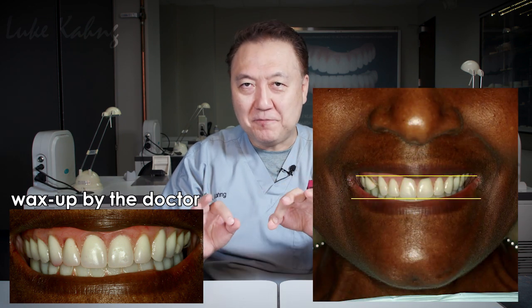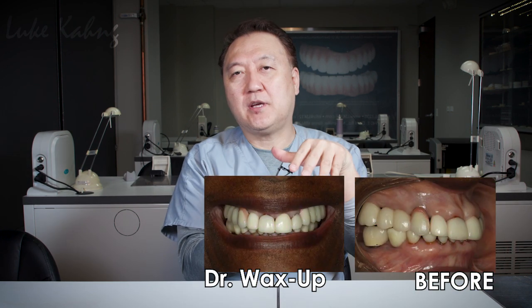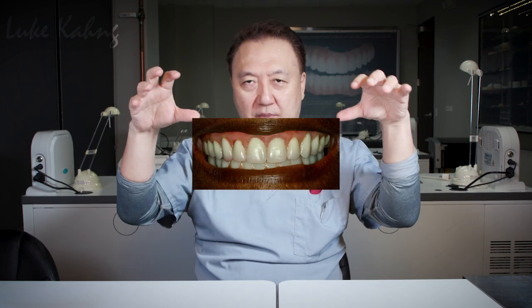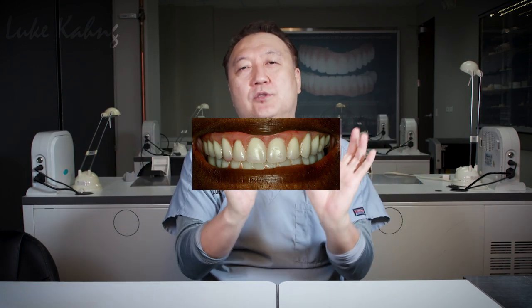His wax-up was received because he wanted to do better. He and I talked — this was the first case — about how we can improve the case from the before state. He fabricated a wax-up design, and the wax-up design is nice. But to me, it's a little gummy — meaning more gum is showing — so we just changed it.